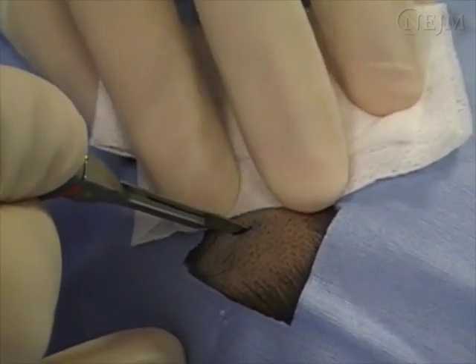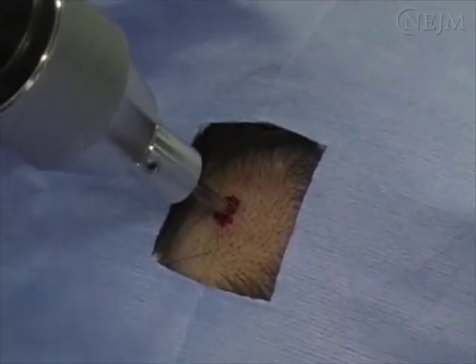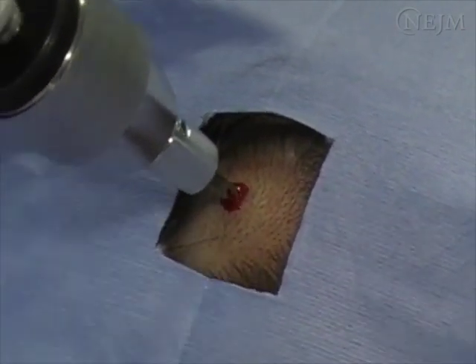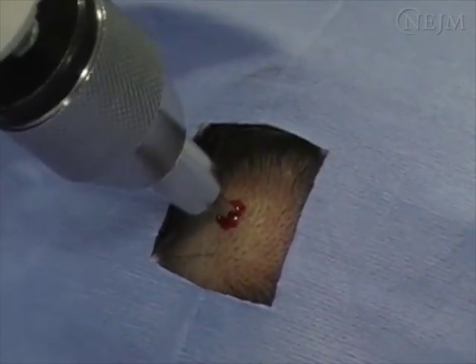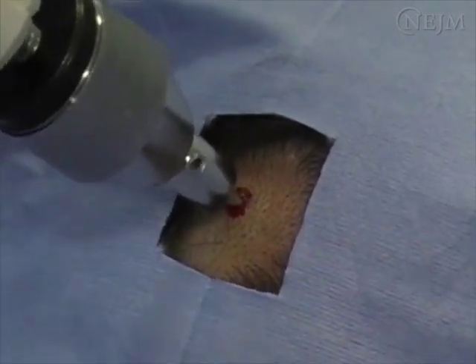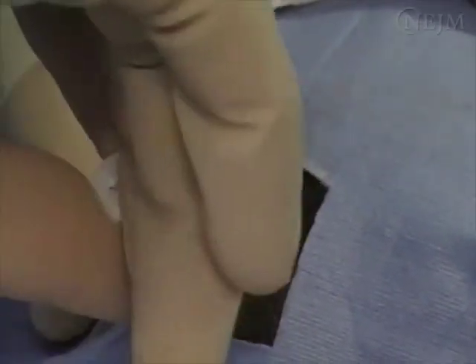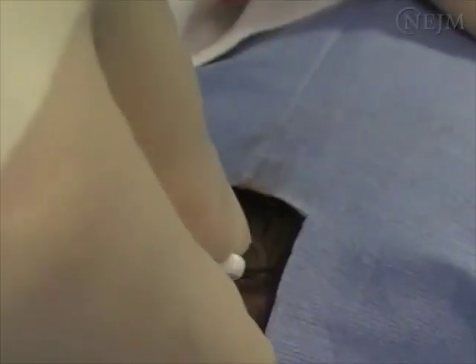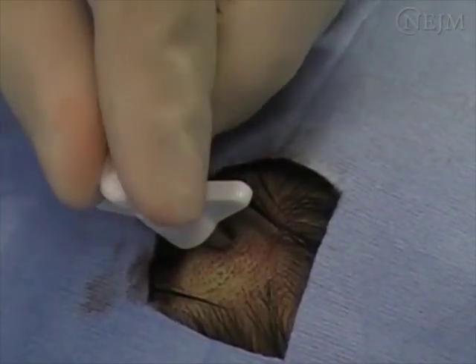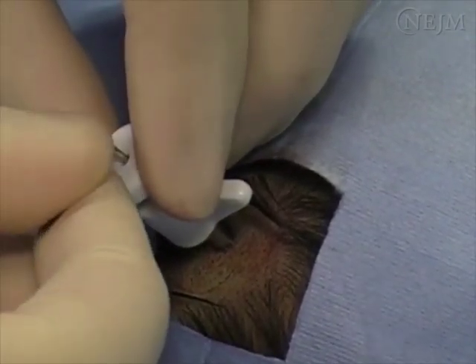Ask an assistant to secure the patient's head. Place the drill perpendicular to the skull and turn the handle clockwise. Do not lean on the drill. You will usually be able to feel the drill bit penetrate the hard outer cortex, the soft central medulla, and the hard inner cortex. Place the bolt in position perpendicular to the skull and turn it clockwise, usually nine half turns until it is secure. Loosen the cap of the bolt by turning the adapter counterclockwise and make a puncture in the dura using the dural puncture stilette.